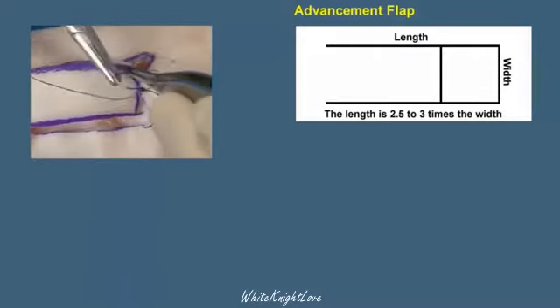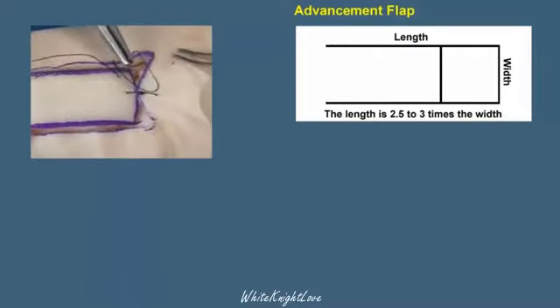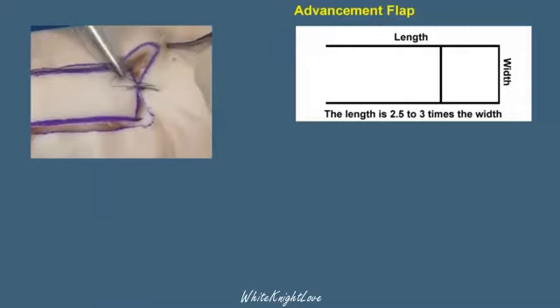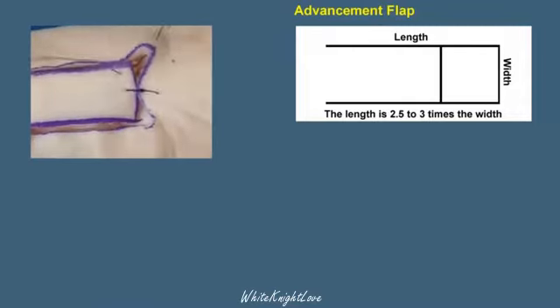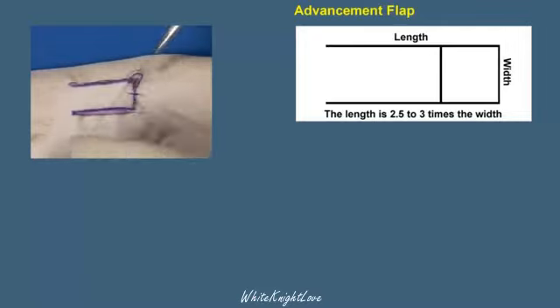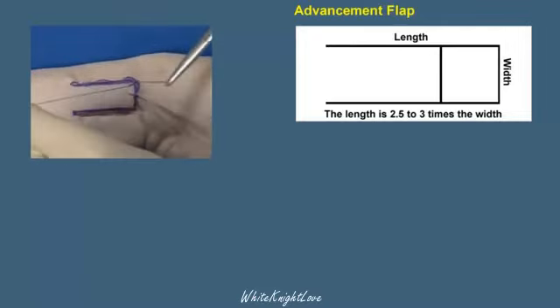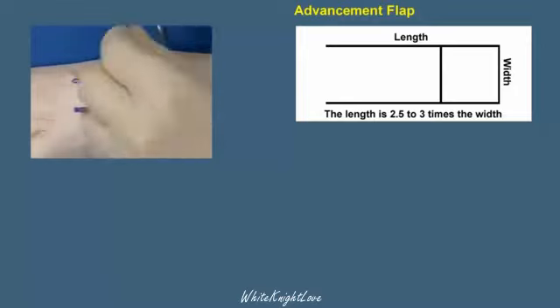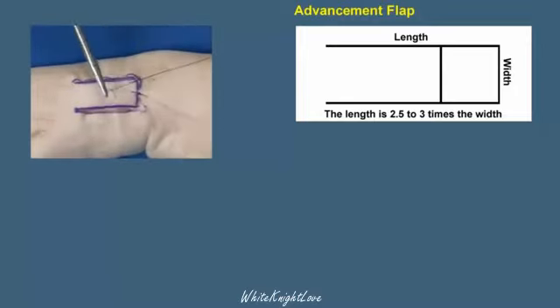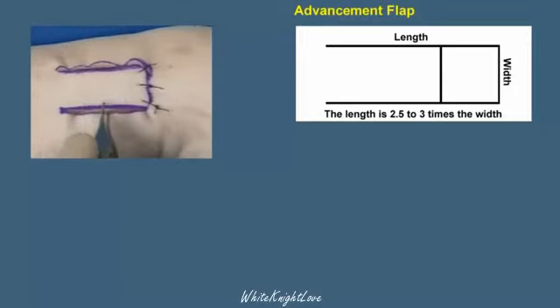That prevents unwinding of the suture material over time. The corner sutures are placed next, since they are the other primary sites of tension in this flap design. Here an instrument tie is being utilized for the corner stitch. Again, a surgeon's knot is put down on the first throw.